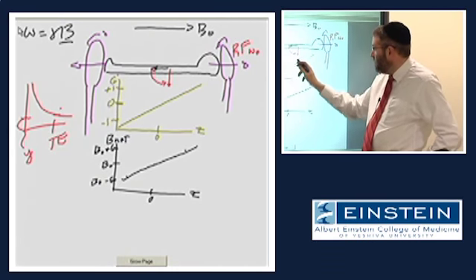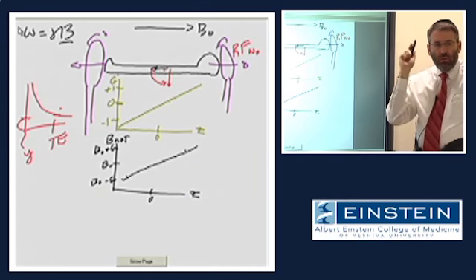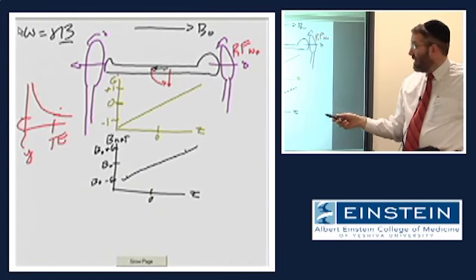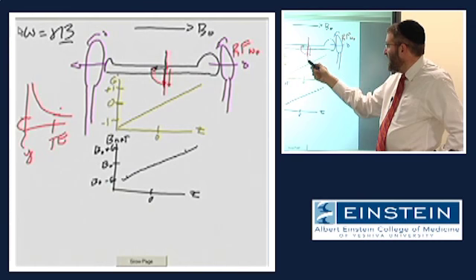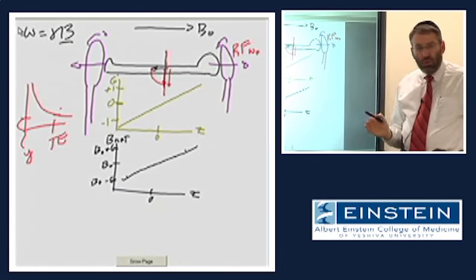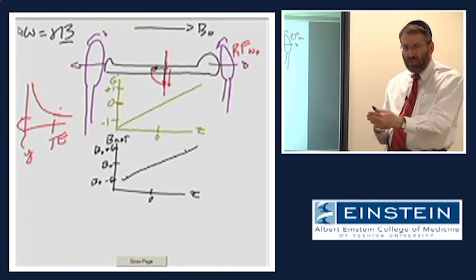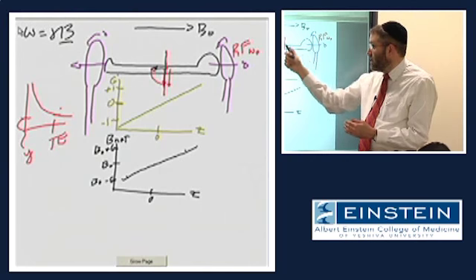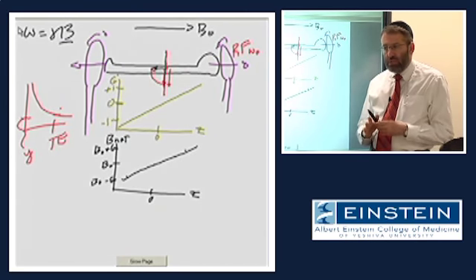So only the spins that lie exactly at isocenter are going to be rotated into the transverse plane. And by the same token, any spins along this plane at isocenter will be rotated into the transverse plane. We'll have net transverse magnetization, which we can detect as signal. Anything on either side, they're just sitting around at rest.